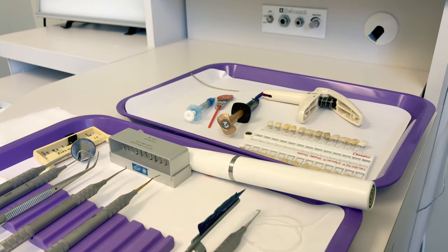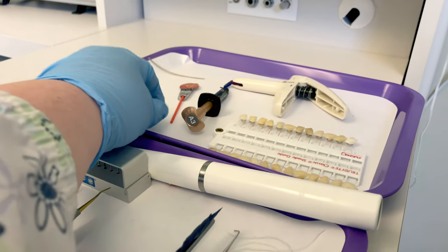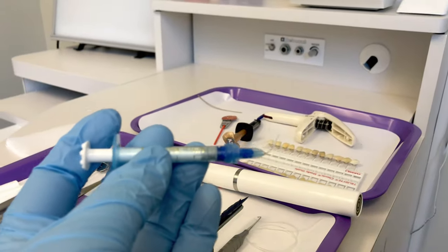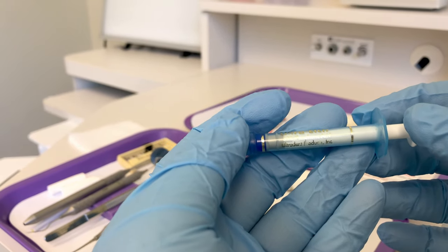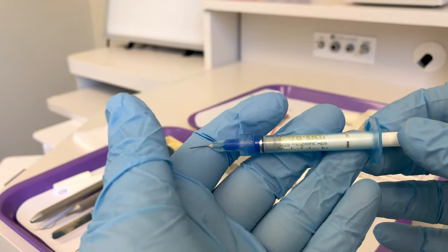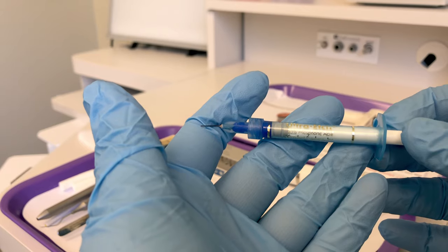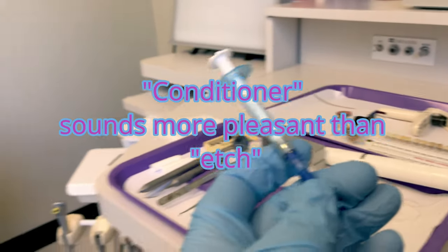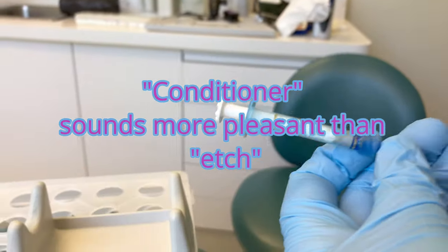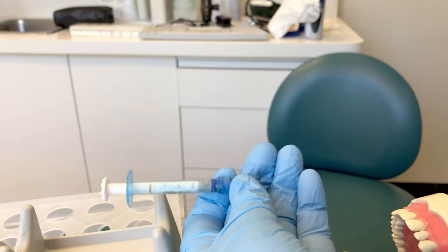With the tooth prepared and a matrix band already in place, the doctor is ready for the etchant, or conditioner. Your conditioner is phosphoric acid, so always wear PPE. You would wear PPE chairside with a patient regardless, but we also have to worry about protection from chemicals such as this acid. We often call this the conditioner.